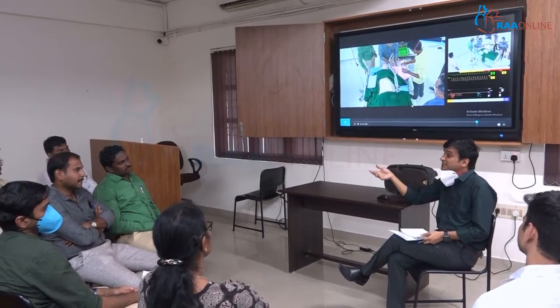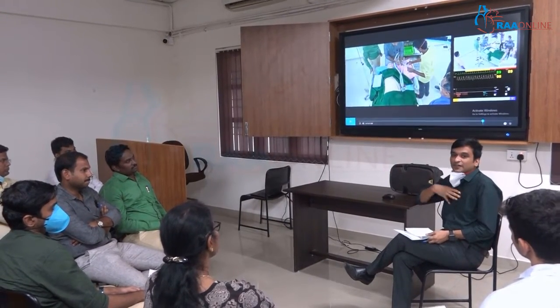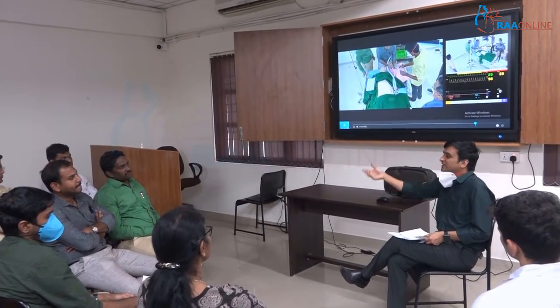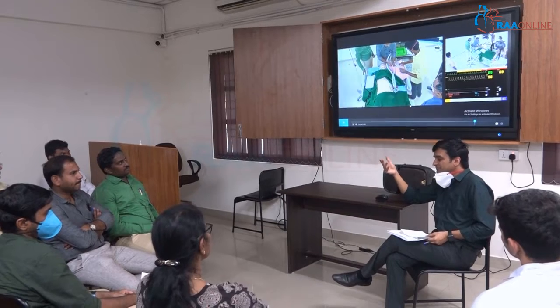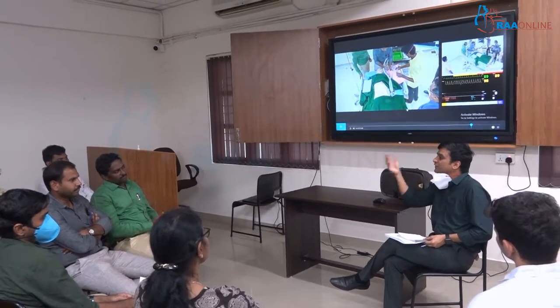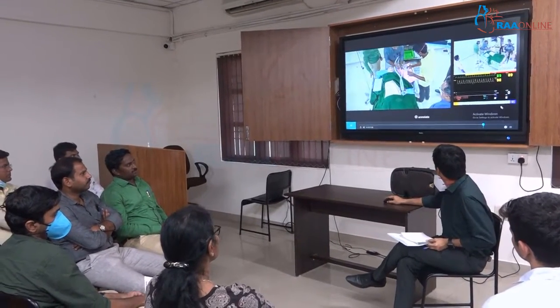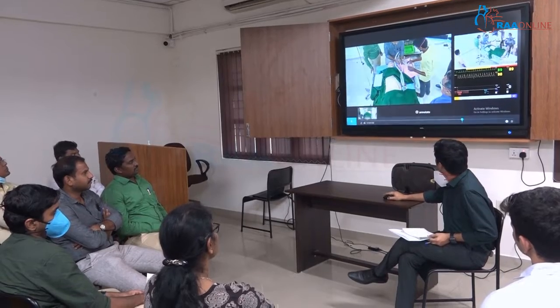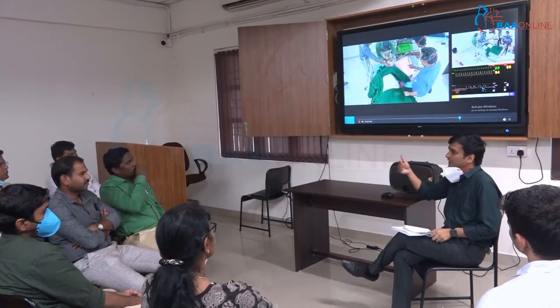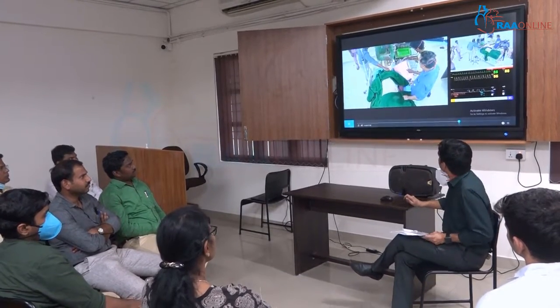So when we are anticipating some difficult airway and when we are pre-oxygenating, I would have liked to oxygenate the patient to the fullest, but of course the end-tidal oxygen and other things were not displayed here. So once we knew that, we would have known that it was not getting oxygenated, right? So we just go back to the attempts. You did, so the sequence was pretty right. So I just wanted to re-stress this is how we go about it.